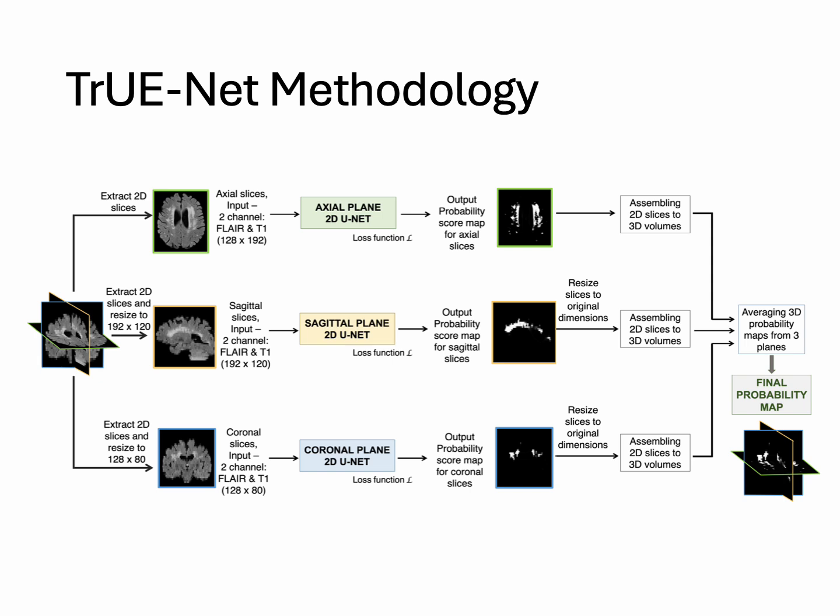since we consider the individual slices separately, the U-Net might not be efficient in obtaining the segmentation of contiguous hyperintensity lesions in a robust manner. So to ensure continuity across slices, we also take in the other 2 dimensions, so as to have continuity along the slices, right? We don't want the lesions to be missed in one of the middle slices, so that there is a discontinuity. That's exactly what we do with this triplanar architecture. It's technically also called a 2.5D architecture because it's not strictly a 3D model.